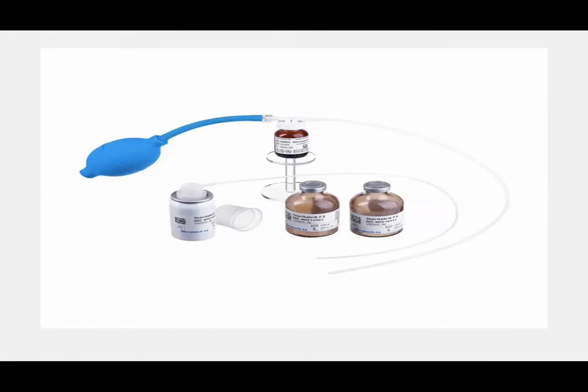The aim at the end is to keep the lung attached with the suction to the chest wall, and it will cause adhesion, so there will be no more space to reaccumulate fluid inside. Other thing, we use the talc. This is an example of the talc we are using.